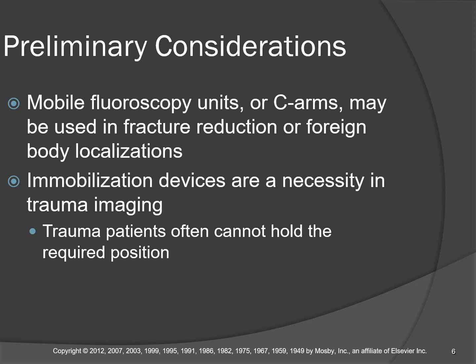You might remember from my intro lecture, if the part has been immobilized, you need to ask permission before removing the immobilizer for the sake of removing the artifact. The facility protocol where you work may have a policy that you're not to remove the immobilizer until after the preliminary radiographic trauma images have been obtained.